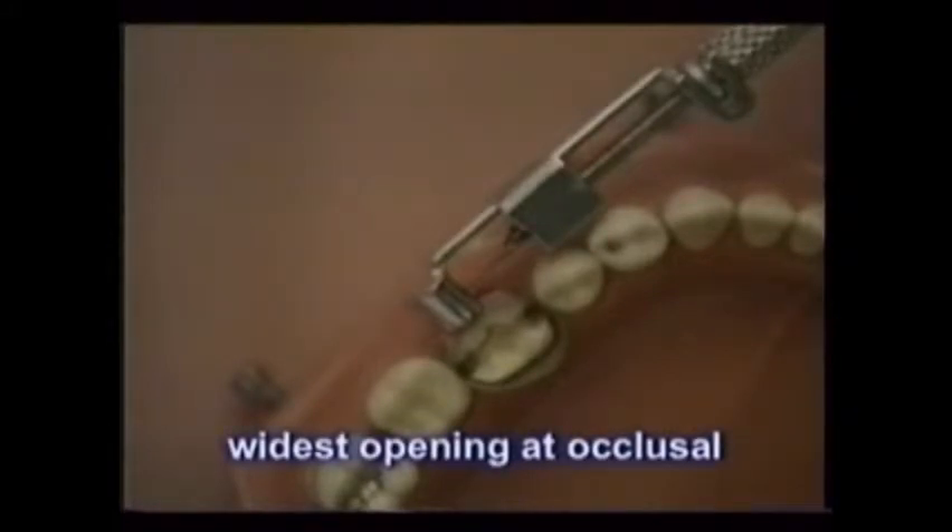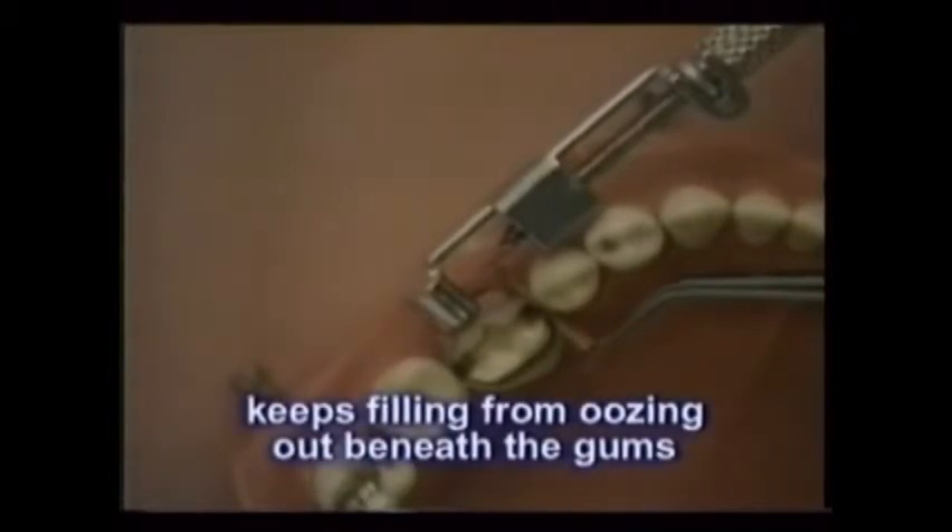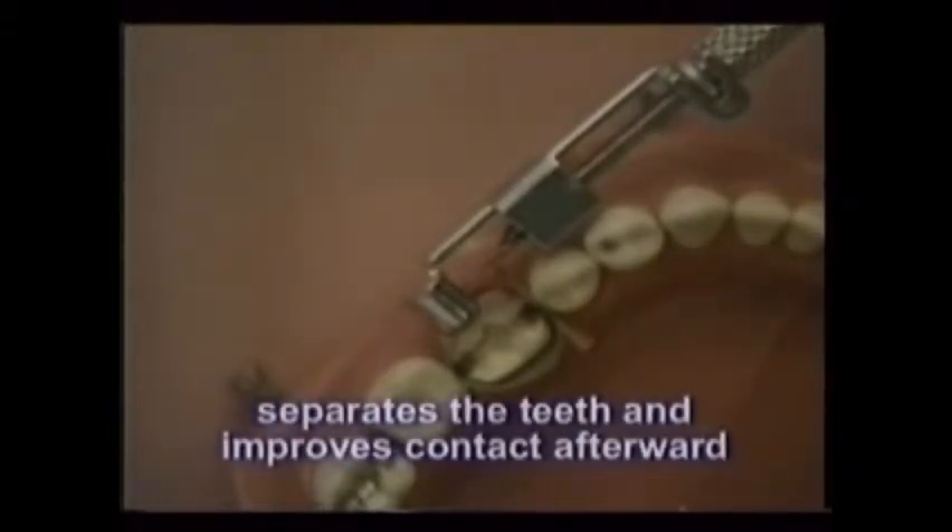Note that the Toffelmeyer and its band are placed with the widest opening of the band at the occlusal surface, much like a right-side-up snow cone cup. A small disposable wooden wedge is inserted between the teeth against the band before the filling is placed. This wedge presses the lowest extent of the band against the treated tooth, keeping filling materials from oozing out beneath the gums. It also separates the teeth slightly and creates a tighter contact between them after the wedge is removed.